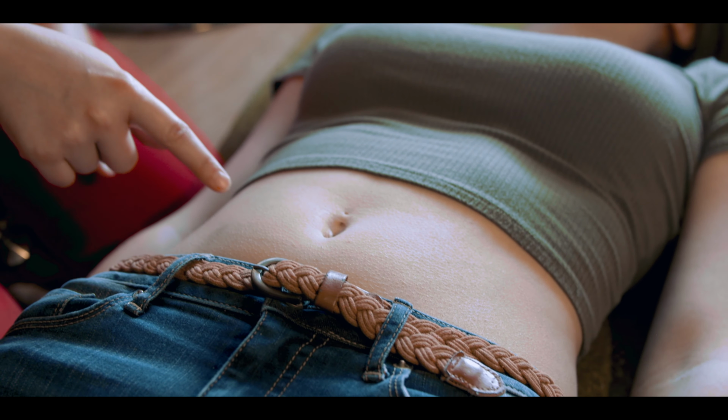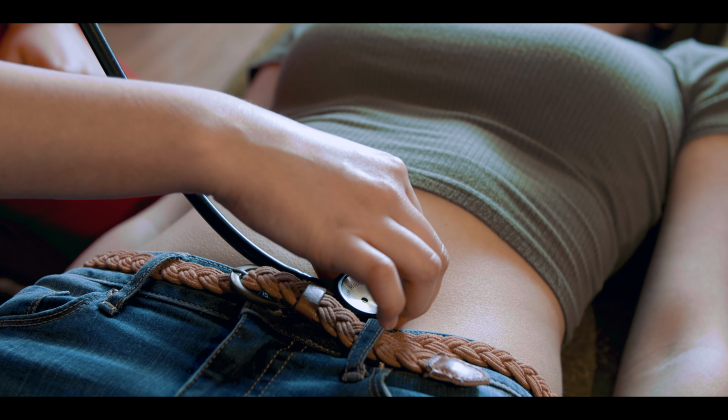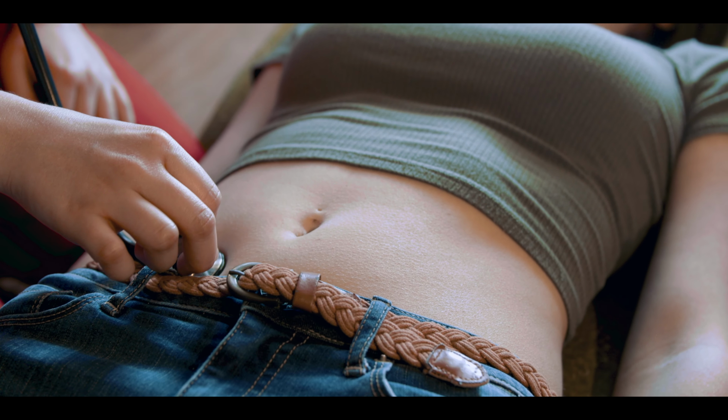The way you listen to the abdomen is you divide it into 4 quadrants, with the umbilicus as kind of the middle point of all the quadrants. I prefer to start in the upper right lobe and move in a clockwise fashion. When you listen, if you're not hearing bowel sounds, be sure to either move your scope and try again, or to listen for a full minute. Sometimes things like tissue or fluid can block the sound, and so moving it and trying to find a different place to listen to can be very important.